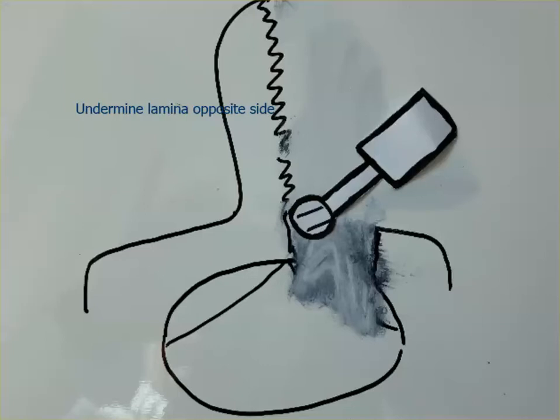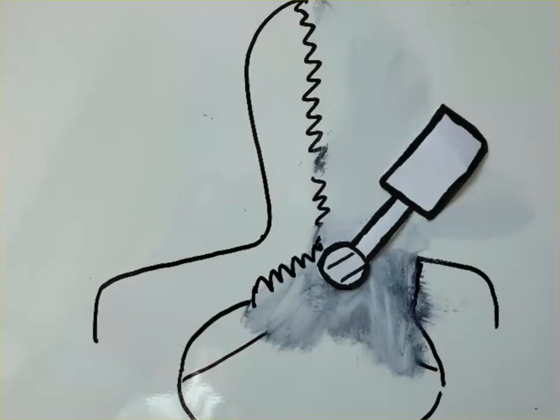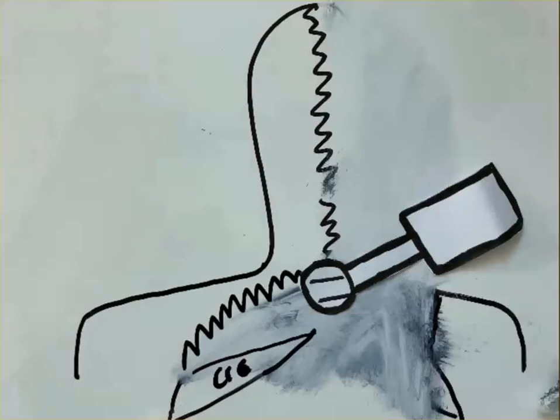So you can imagine on the other side, all the muscles are intact. So only half the spine's exposed, and that decreases morbidity for the patient. Then you burr down the other side from the opposite side, and you remove all the bone there, opening up the channel. You're left with the ligament, and then you remove the ligament with a kerrison. Does this make sense? A little bit?